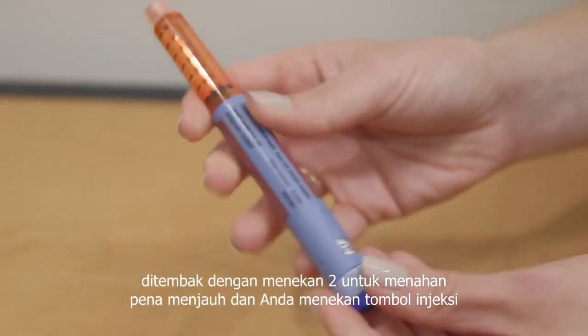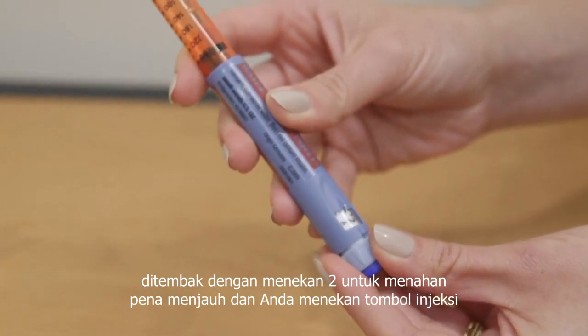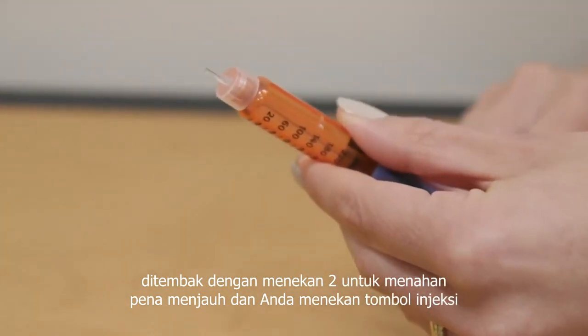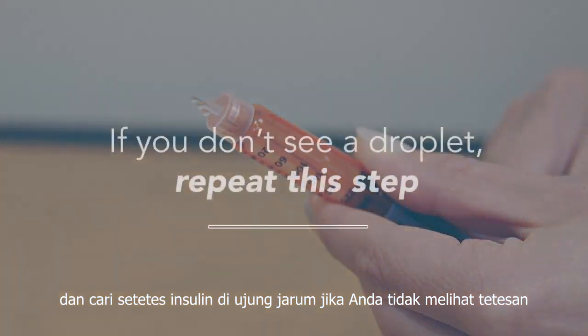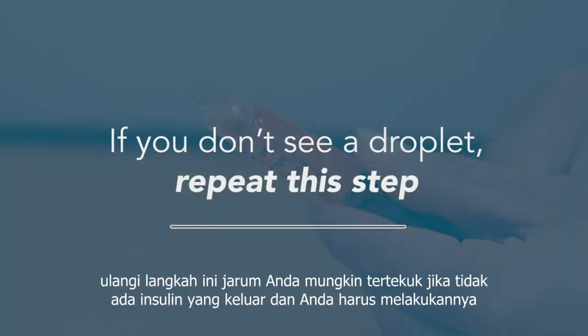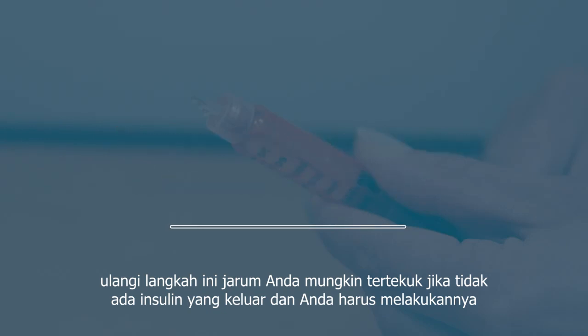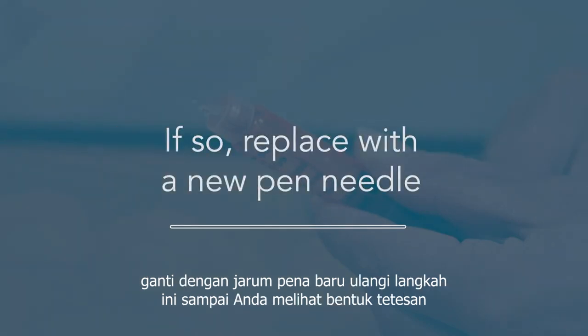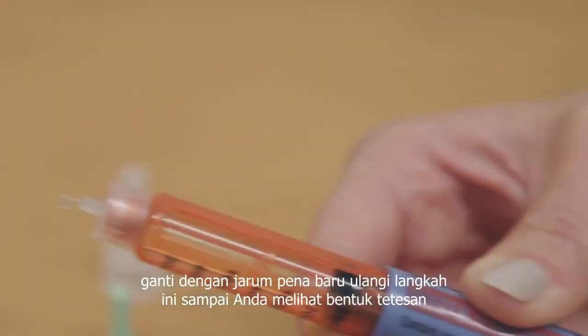Perform an air shot by dialing to 2. Hold the pen up and away from you, push the injection button, and look for a drop of insulin on the needle tip. If you don't see a droplet, repeat this step. Your needle may be bent if no insulin comes out, and you should replace it with a new pen needle. Repeat this step until you see the droplet form.